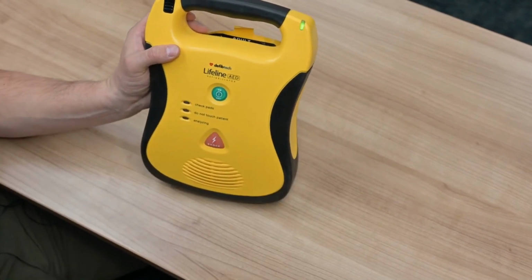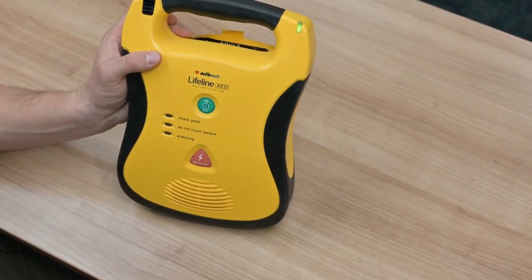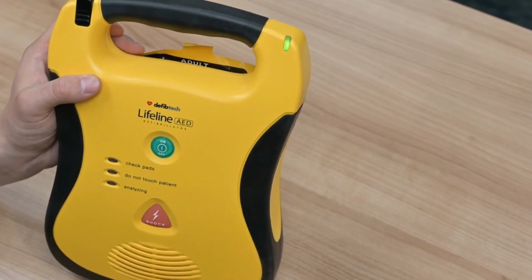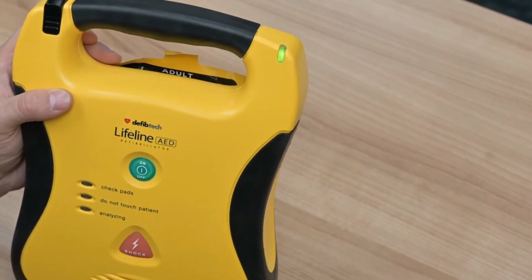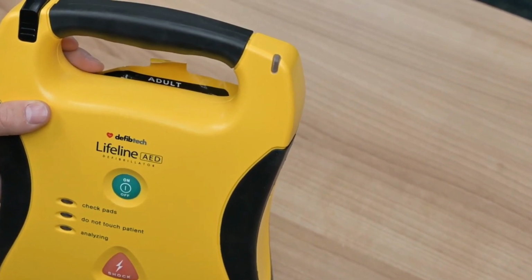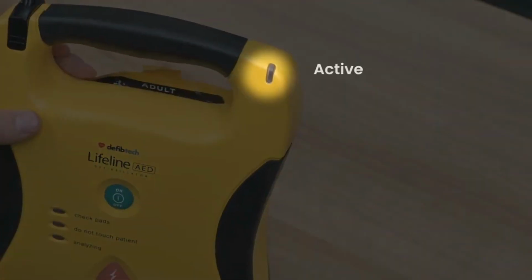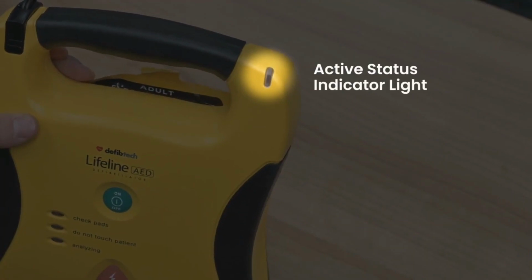Performing battery test. Battery OK. Powering off. After the device performs its battery test, you should see the active status indicator light flashing green every few seconds.